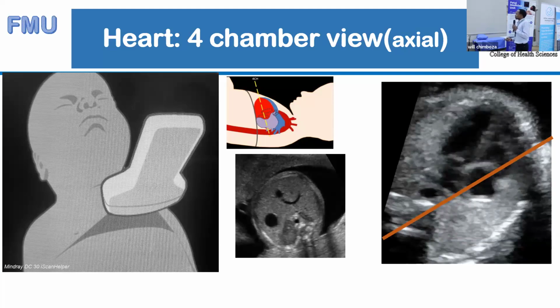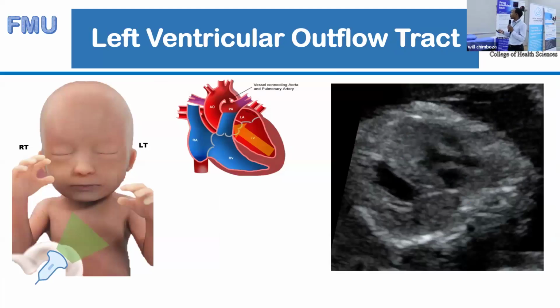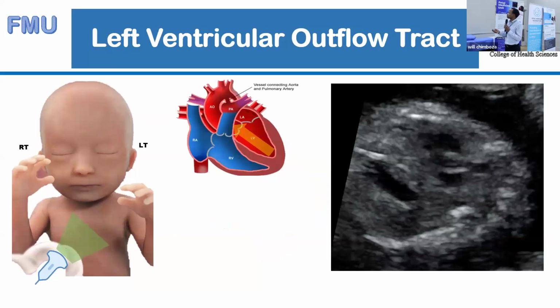Then from this view, we move on and go on to the left ventricular outflow tract. So for the left ventricular outflow tract now, I think my videos.